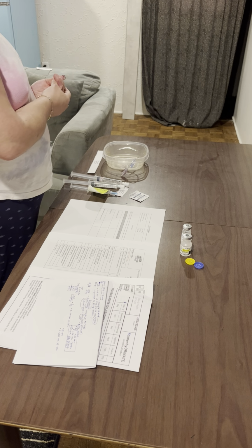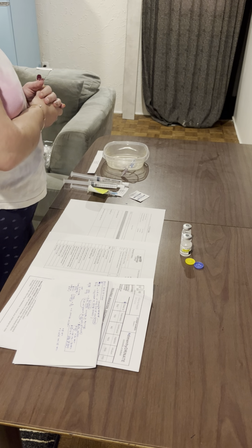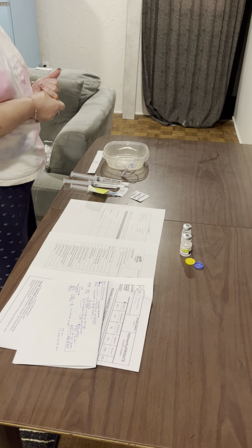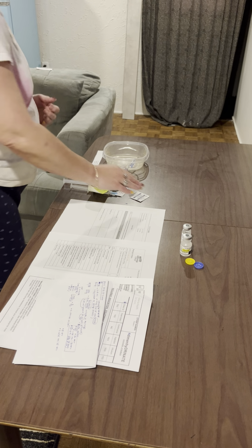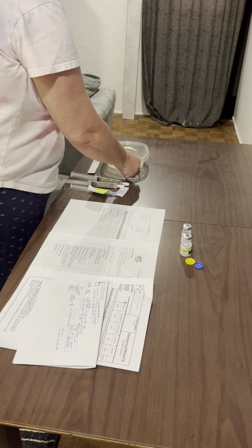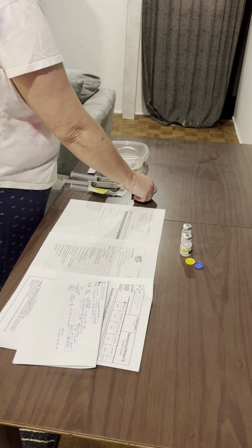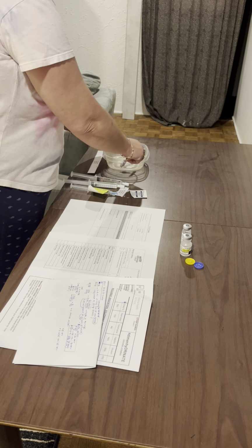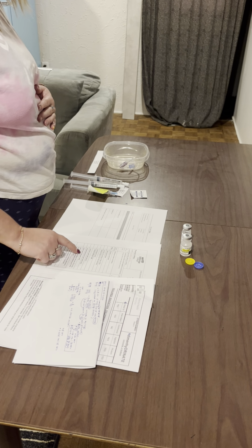So do you have any questions about the procedure? Anything at all you'd like to ask? Okay, all right, great. So if you're ready, I guess we'll get going. Is that okay? Great. Okay, so the first thing we're going to do is we're going to look, and our patient here has a saline lock, meaning obviously that it's locked right now, and that is as physician ordered, saline lock between meds, so that is absolutely correct.